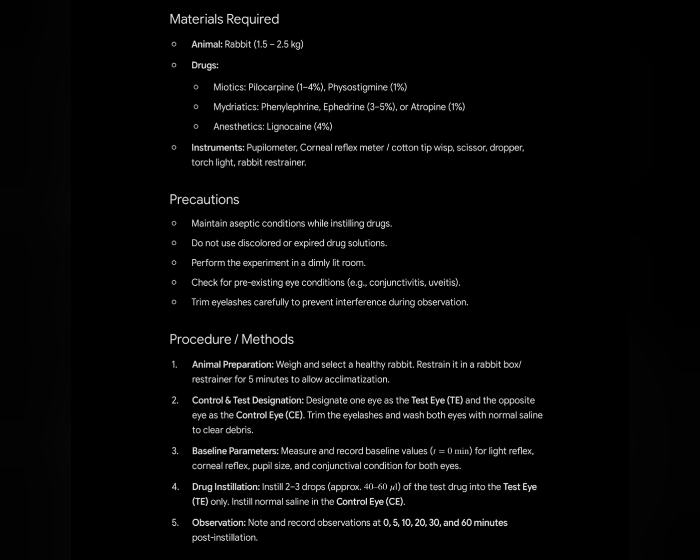Precautions: maintain aseptic conditions while instilling drugs. Do not use discolored or expired drug solution. Perform the experiment in a dimly lit room. Check for pre-existing eye conditions, for example conjunctivitis, uveitis. Trim eyelashes carefully to prevent interference during observation.